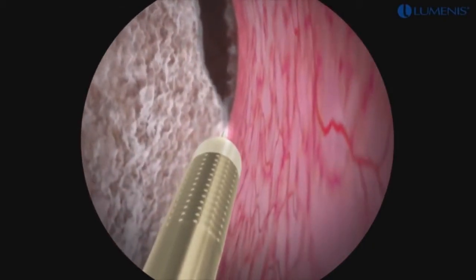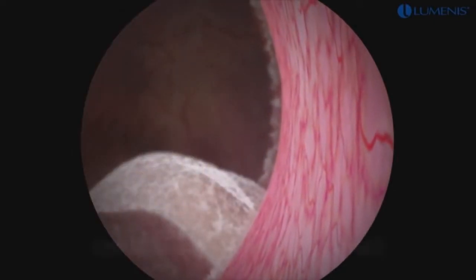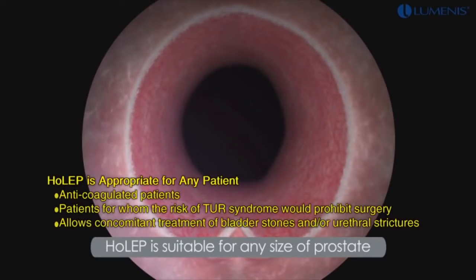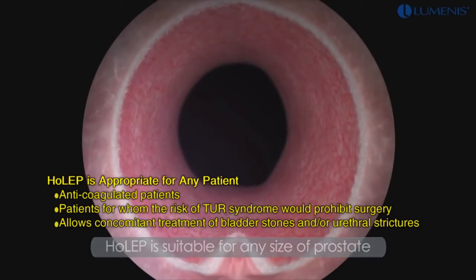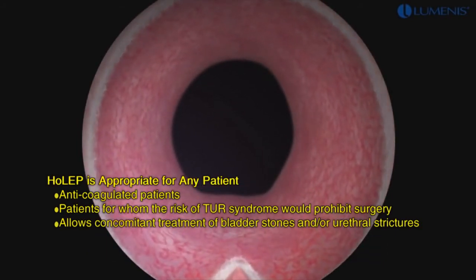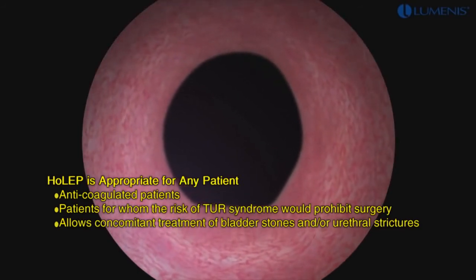When completed, the lobes are again pushed into the bladder using the beak of the resectoscope. HoLEP is suitable for any size of prostate, as the procedure removes the lobes from the capsule regardless of their size. Before the morcellation is started, it is important to inspect the prostatic fossa and achieve hemostasis in order to optimize visualization.